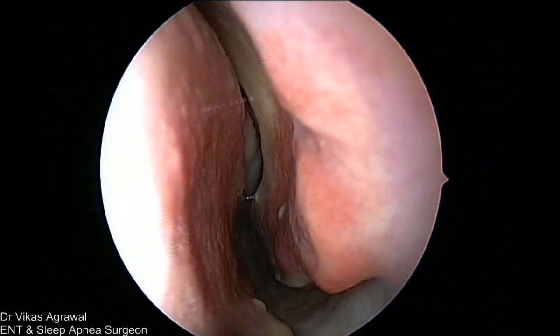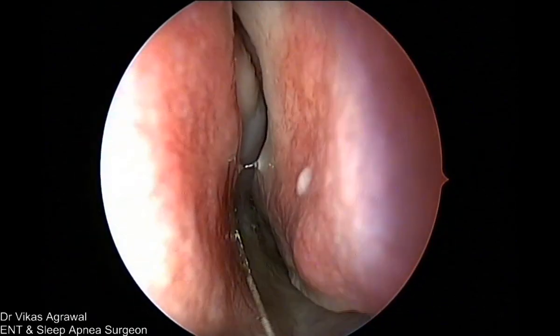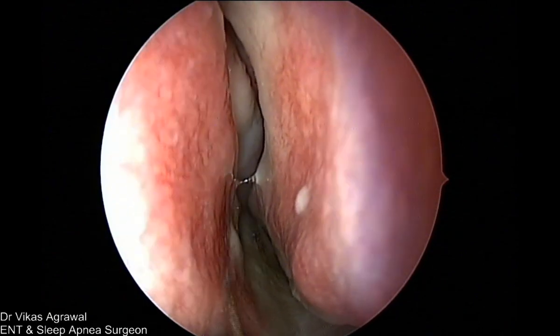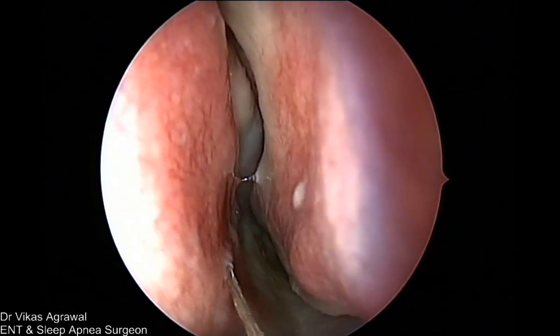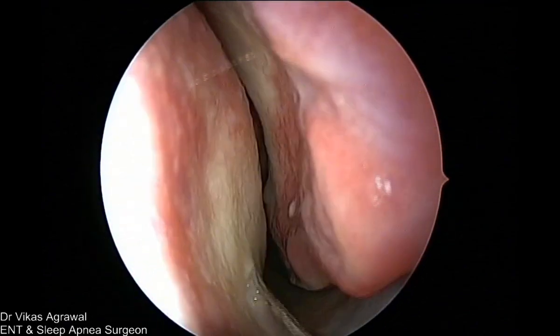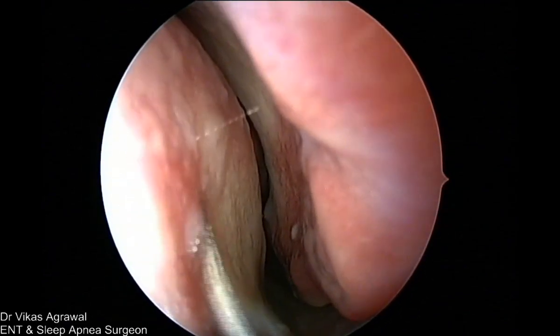So we understand. I'm infiltrating. I'll do an endoscopic septoplasty so that all of you can see. I'm infiltrating the lower part. I'm infiltrating the higher part.